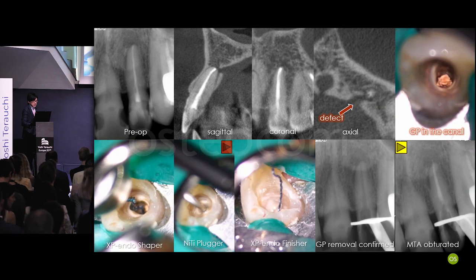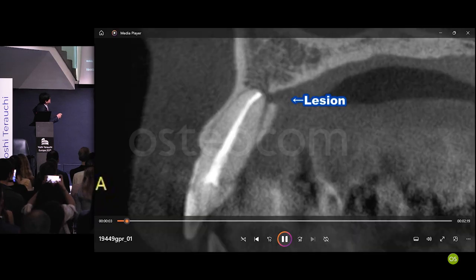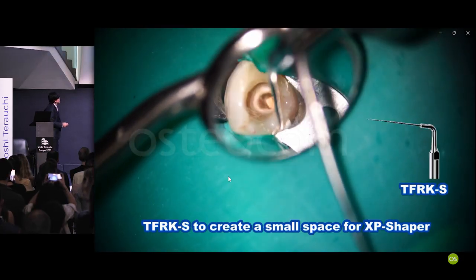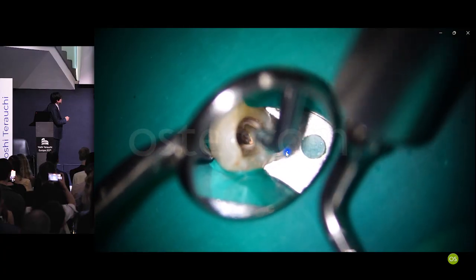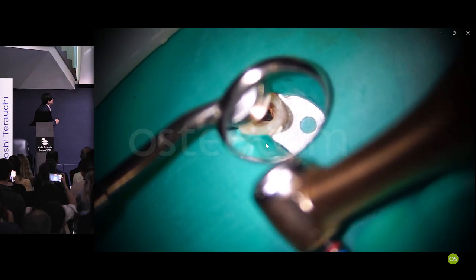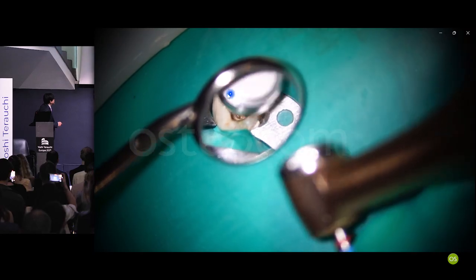So let me show you how I do this. So this is the gutta percha. This is apical radiolucency here. First, I create a space with the TFRKS, the straight tip. So the space is created between the gutta percha and the root canal wall. Then I'm going to introduce XP shaper. I'm rotating the XP shaper at 2,500 RPM with a small up and down motion.